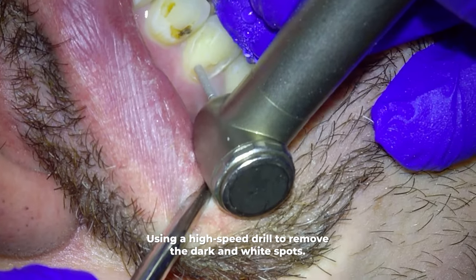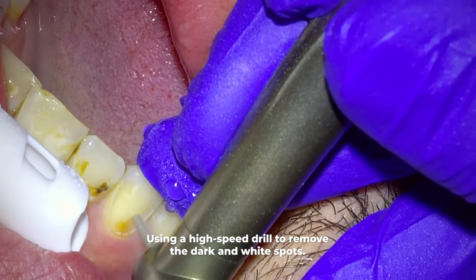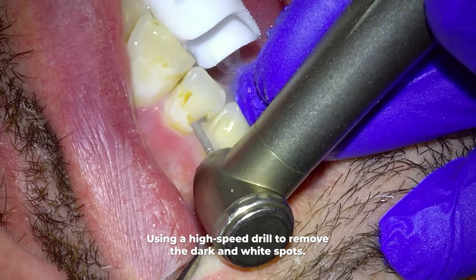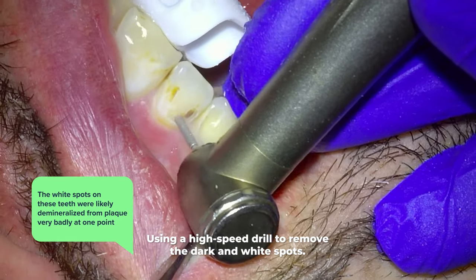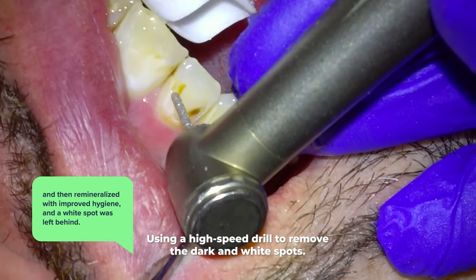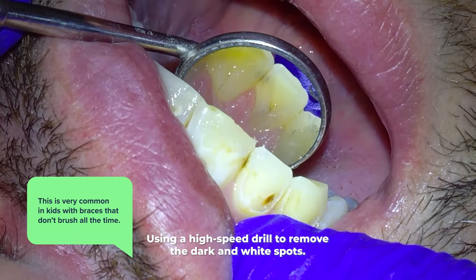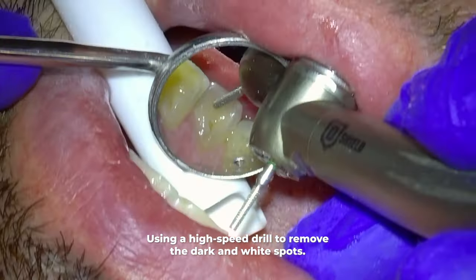After I remove the dark spots, I'm also going to remove all the white area around these teeth as well. These white spots aren't necessarily tooth decay — tooth decay is actually just an aggressive form of tooth demineralization. The white spots on these teeth were likely demineralized from plaque very badly at one point, and then at a later point remineralized with improved hygiene, leaving this white spot. This demineralized-then-remineralized look is very common in kids with braces who don't brush all the time, because they get lots of plaque around the braces and the demineralization and remineralization process leaves those white spots.